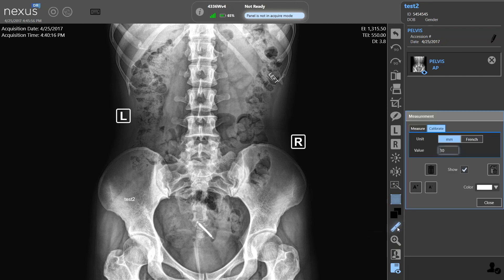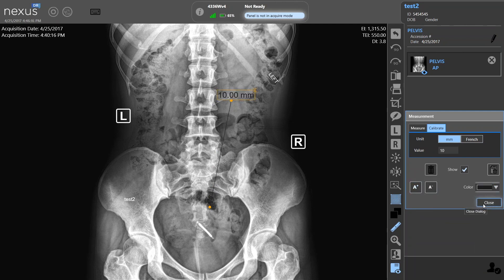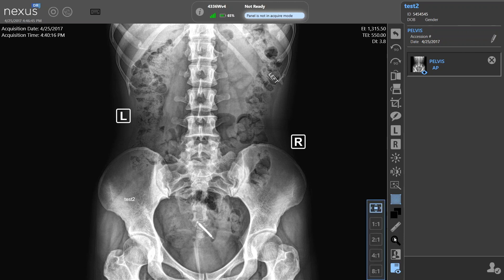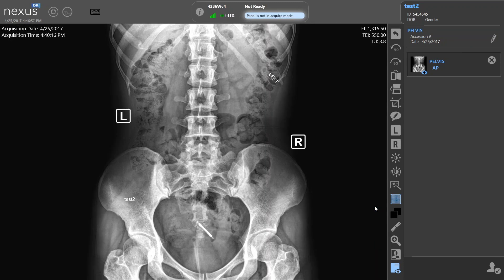You've also got access to standard tools like a measurement tool where you can measure in millimeters, or you can change the measurement calculation into inches depending on what you want to see. You can make the annotations larger or smaller, and you can also change the color of the annotations depending upon the background and where you're trying to place them. You also have access to a zoom tool which will allow you to zoom in on the image at a one-to-one or two-to-one ratio, depending upon the region of interest. To get back out, simply click on the top button and it gets you back to the original view.